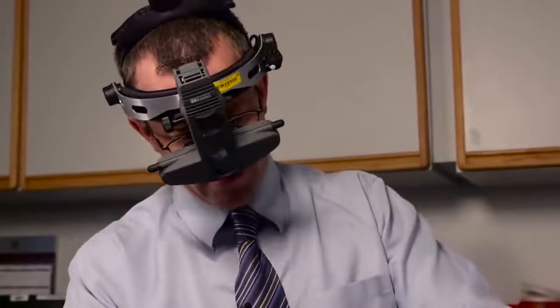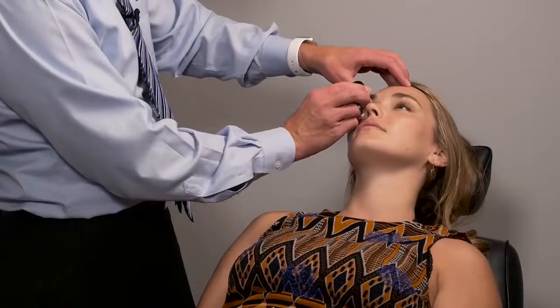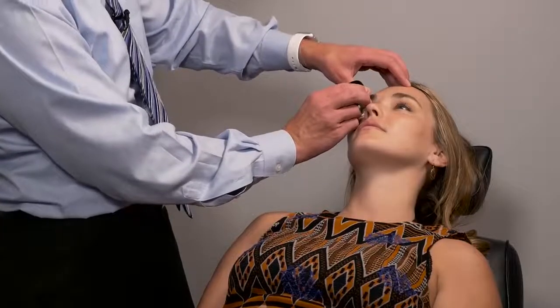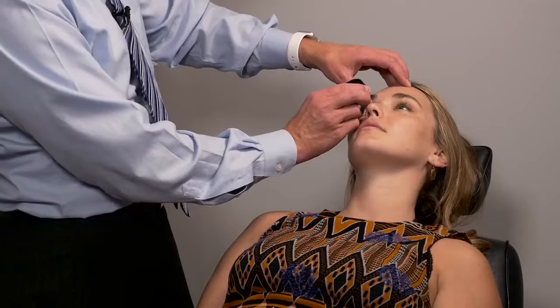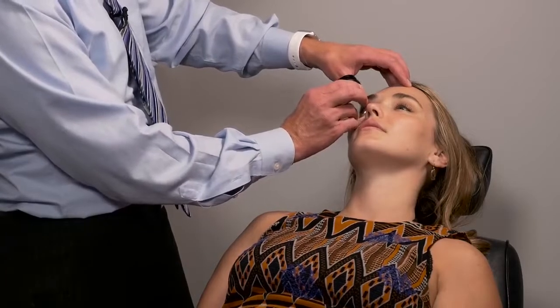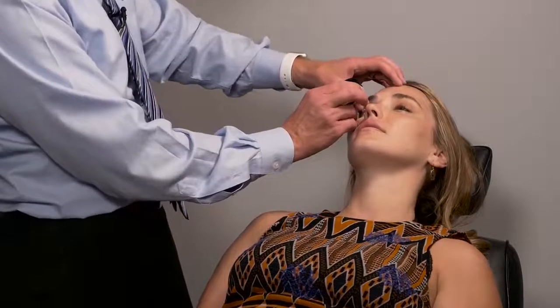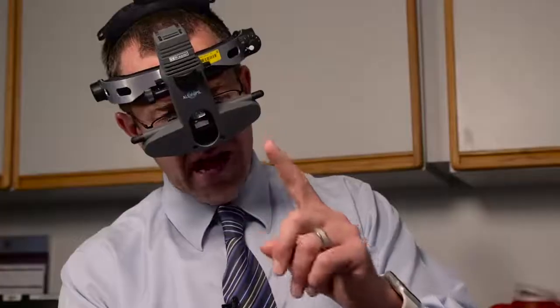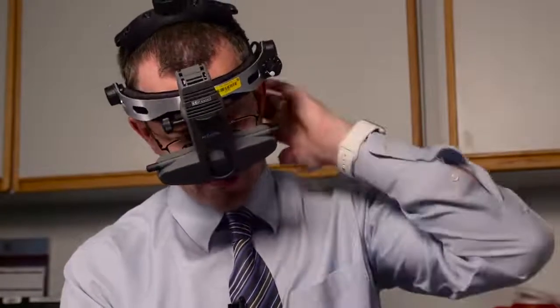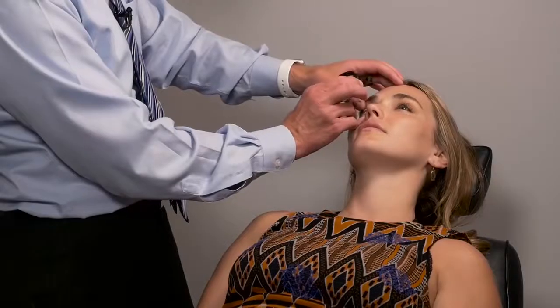I'm used to it. I know kind of where mine is. So again, you'll focus in, you'll see the cornea and the iris in clarity, and you'll see an orange-red reflex. When you see that, with your thumb and your pointer finger, you're going to pull that lens out towards your eye. Sometimes you have to move in a little bit, sometimes you don't. In general, it's a good habit to keep your head distance the same and just learn to move this lens in and out.